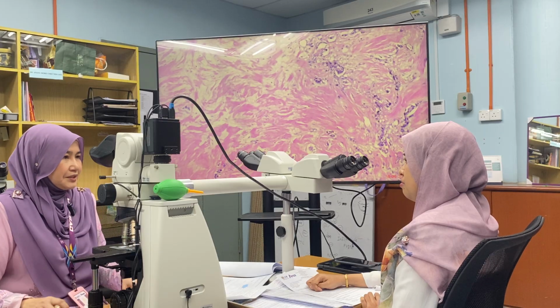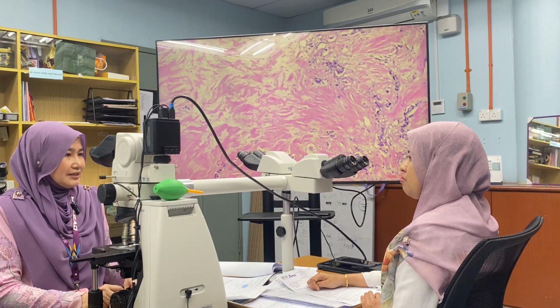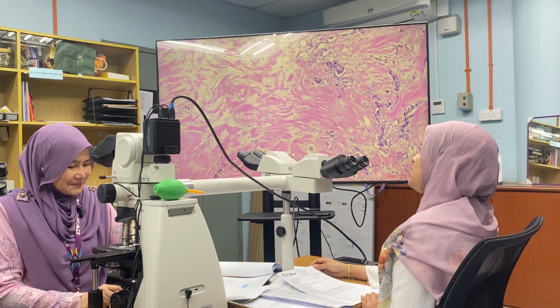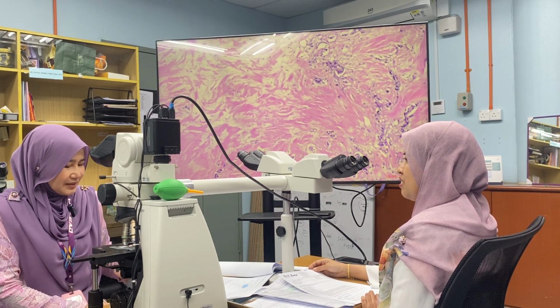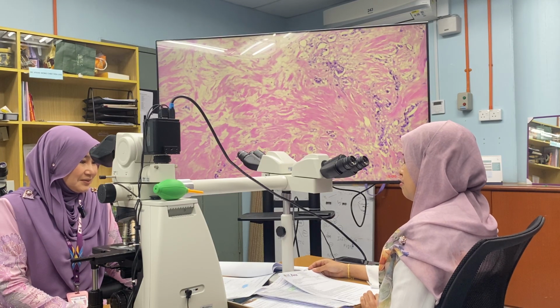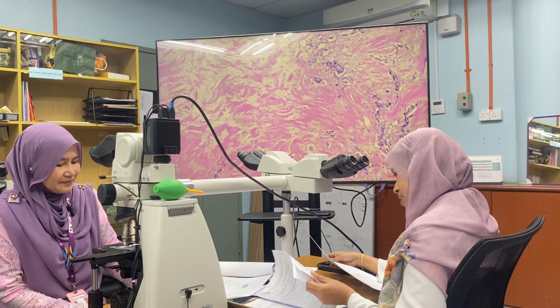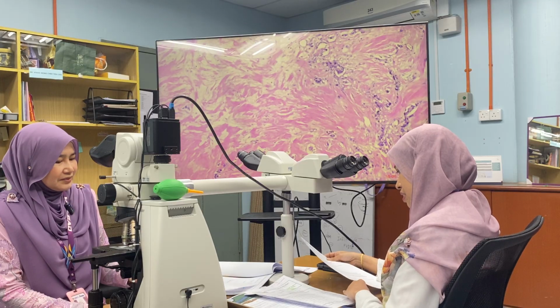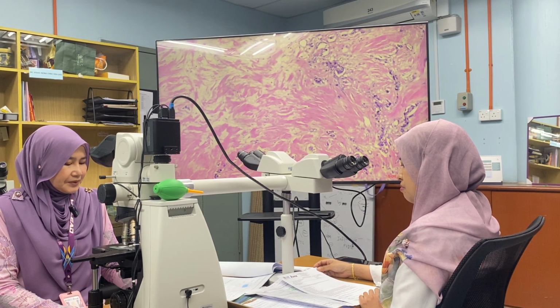So the number of lymph nodes here is 9, right? Yes, I identified 9. Do you think that's enough? It's supposed to be as many as possible, but the minimum is 10. Yeah, and then one more thing is the largest diameter of the tumor metastatic focus. So do you measure the largest? The largest is 10 mm. 10 mm within the axillary lymph nodes. All right. Okay.